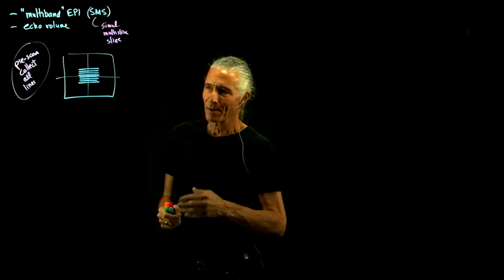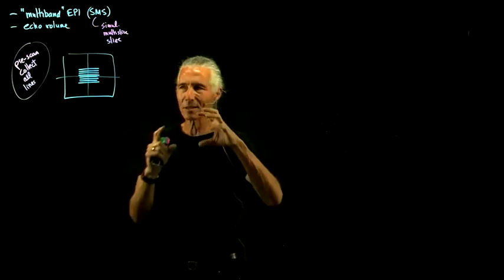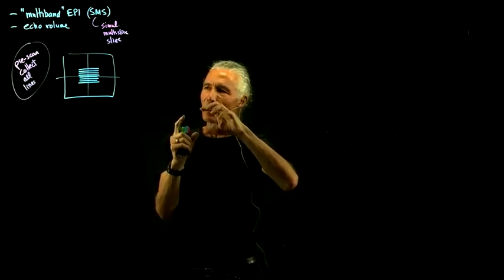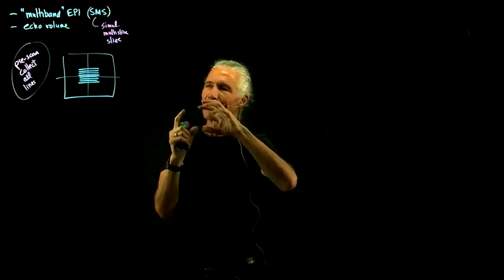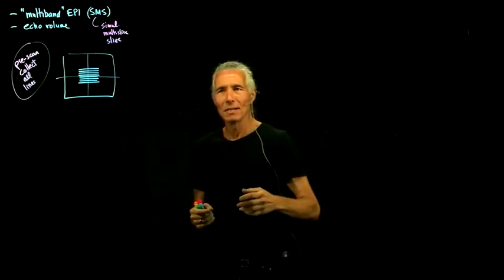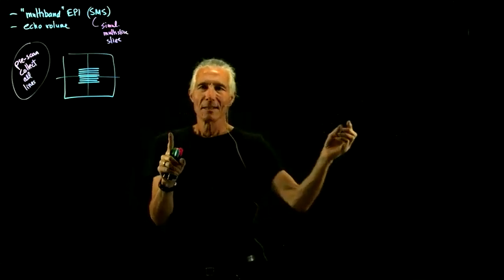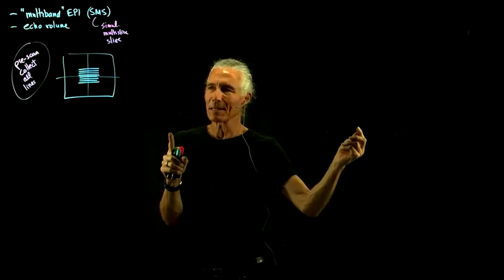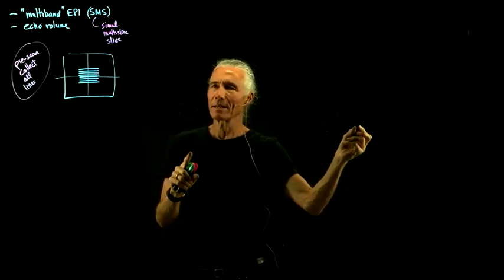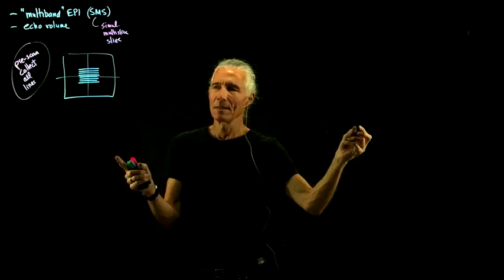But if we have a coil that has a hotspot in it, that causes a single spatial frequency in k-space to be smeared to the surrounding spatial frequencies. That's like the variation in brightness across the coil.